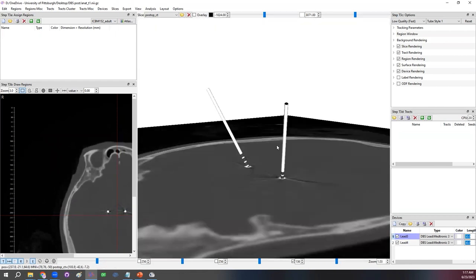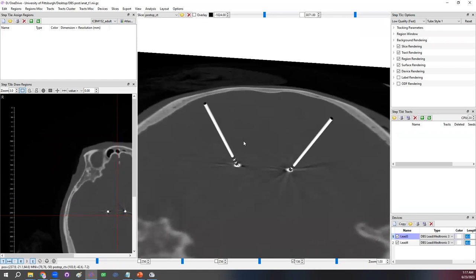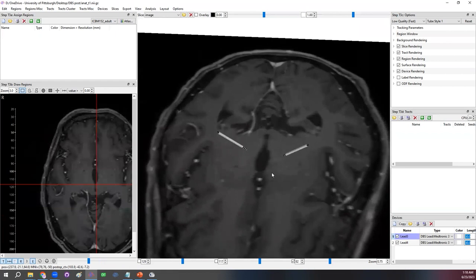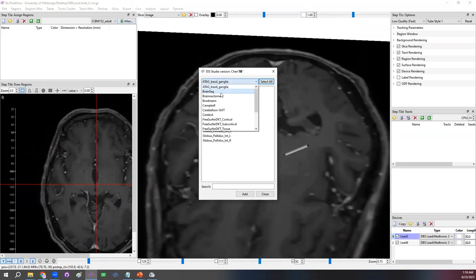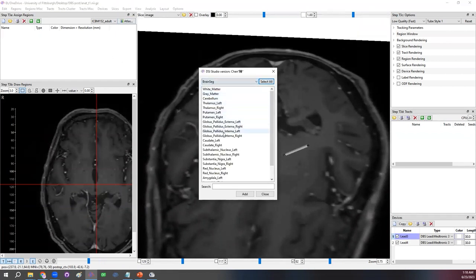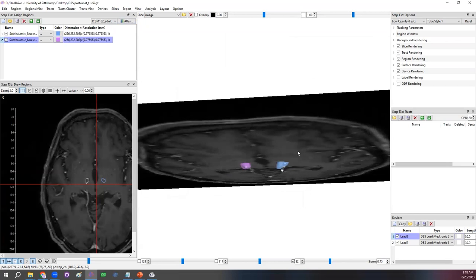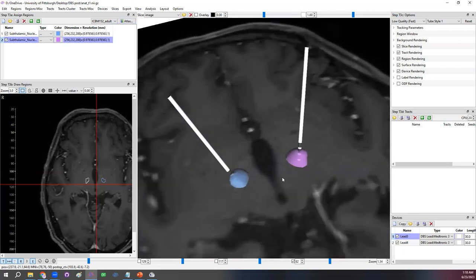Once you have aligned the location, we can look at the T1 image and similarly bring in the atlas — for example, the subthalamic nuclei — and see how the electrode intercepts with those regions.